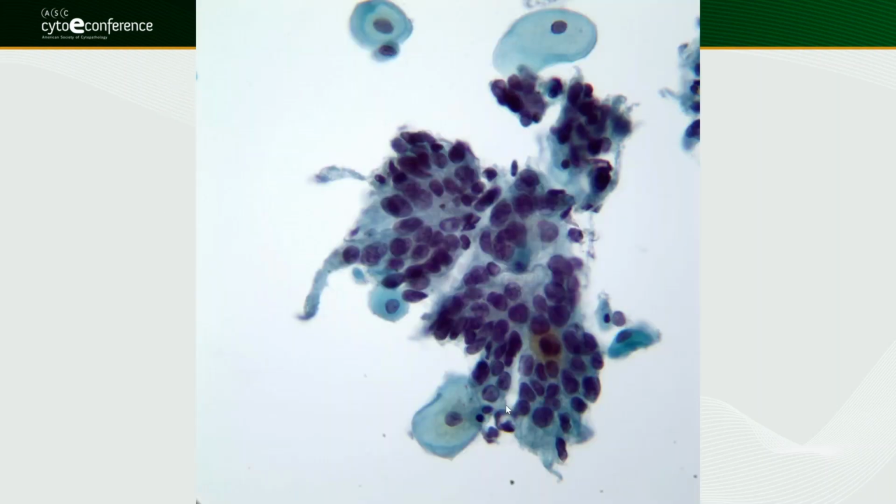So here, you'll notice that it's again elongated, but this is much darker. It's more hyperchromatic, and it's more crowded. You may see little acinar structures, and much more disorganized, and that vesicular type of chromatin and the nucleoli are completely not here anymore. So this is definitely worrisome. And then this is when we say atypical endocervical cells favor neoplastic.